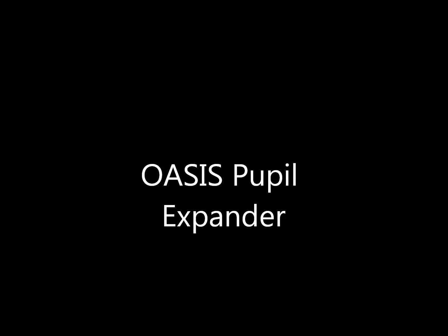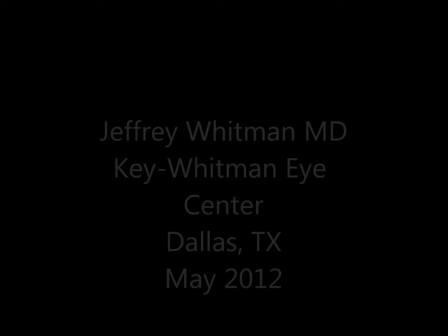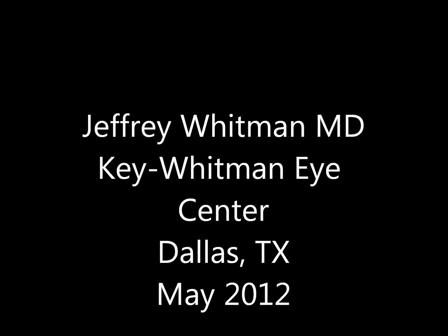This is Dr. Jeffrey Whitman describing the insertion of the Oasis Pupil Expander. This is actually my second use of the instrument and, as you can see, even then it's quite easy.